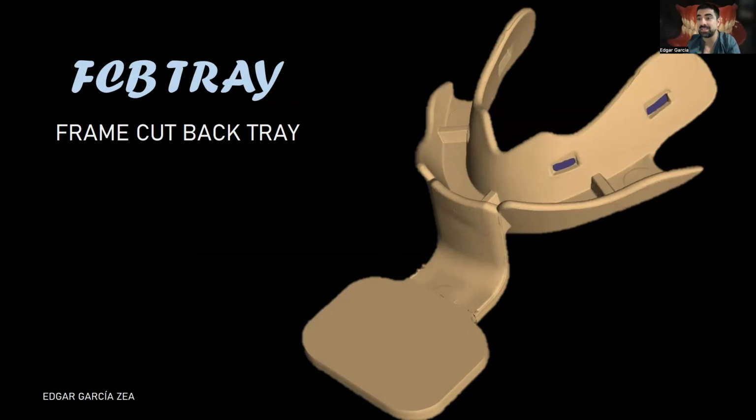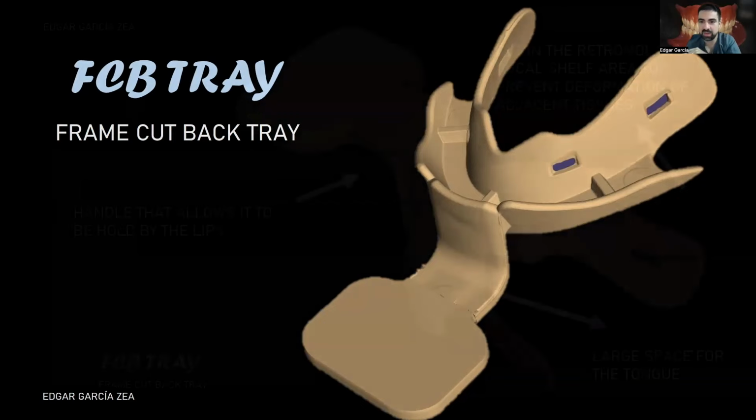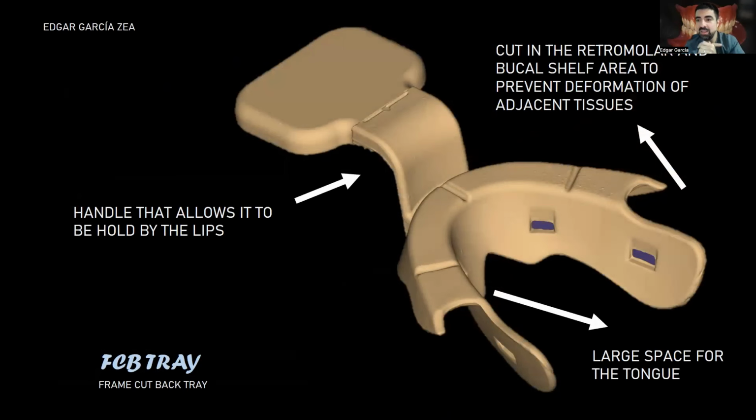This is a tray that is different from the metal ones we used to use, which have an alien form of lower jaw because they don't look like a lower jaw impression tray. This is the frame cut back tray, okay? This tray is special because, as you can see, it has a space where the buccal shelf area and the retromolar pad are. But some people say, why is it not covering the most important part of our denture?